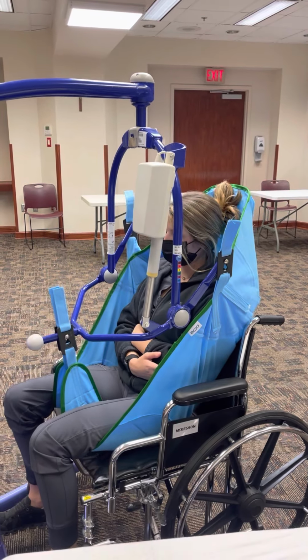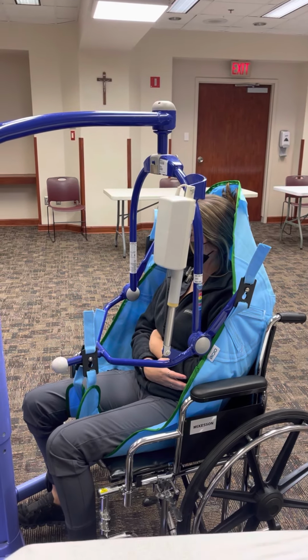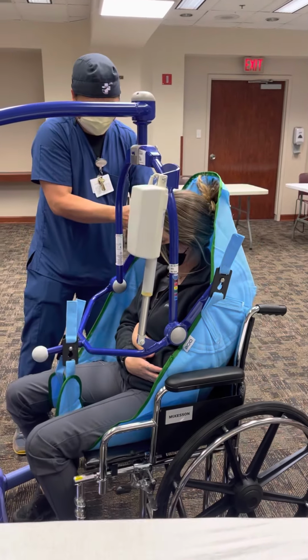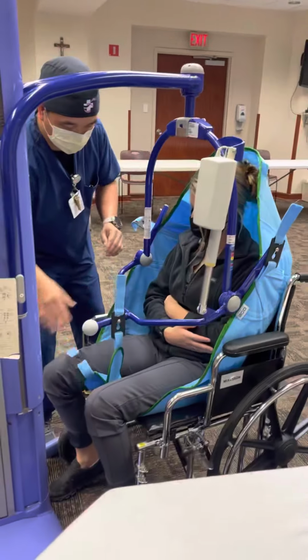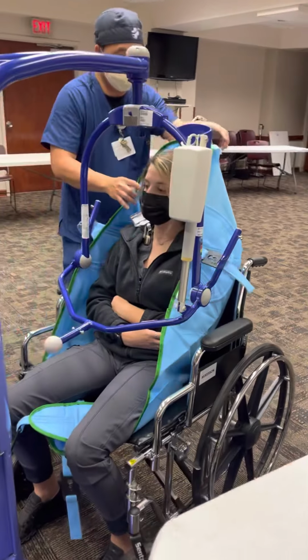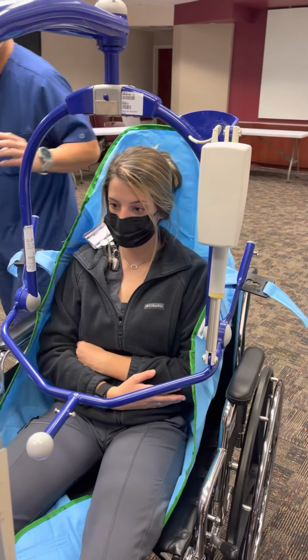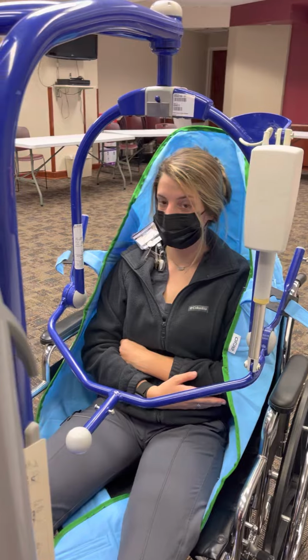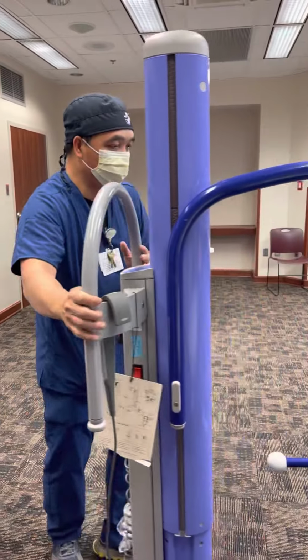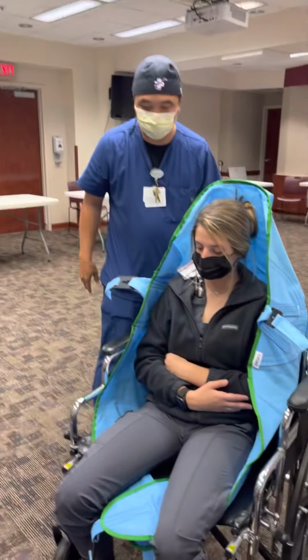Now this is an easy transfer, but still requires two persons for safety most of the time because of the lines, and to make sure that the chair doesn't tip and stuff like that. So we undo this. Once you have a little slack, then you can undo it from there. Okay, now this sling should be taken out if the patient has to sit up in the chair for a long time, or recliner. If they're sitting on a bedside commode for maybe 10 minutes or so, you can leave it there as long as their bottom is clear, and then they can use the bathroom, use the commode.